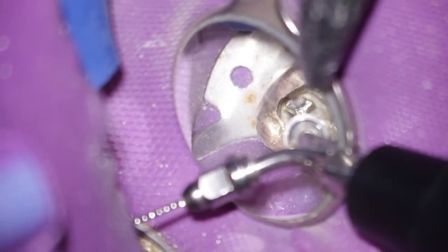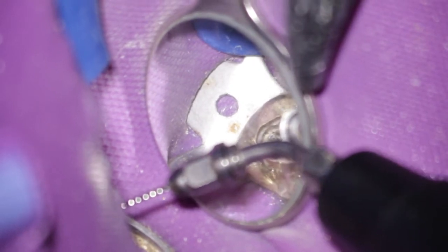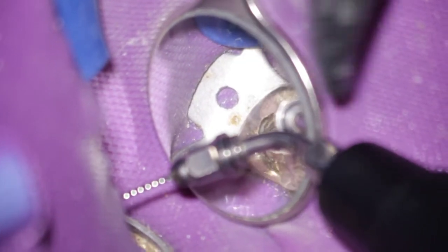To reach deeper areas of the cement gap, very fine instruments have to be used, so the endosonic files are very suitable for this. They are used with a so-called endo chuck, where they are chucked in. But be aware of the energy you operate with them, because they break very easily when they oscillate with too much energy and without contact to a solid material. When you want to use them for irrigation, then turn down the energy to 1/3 of the maximum.